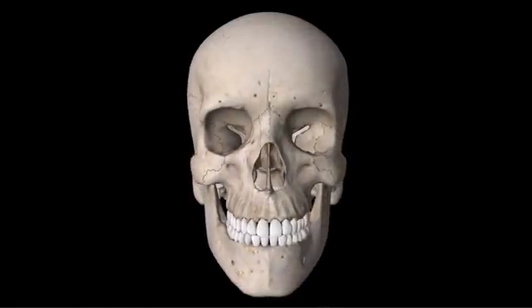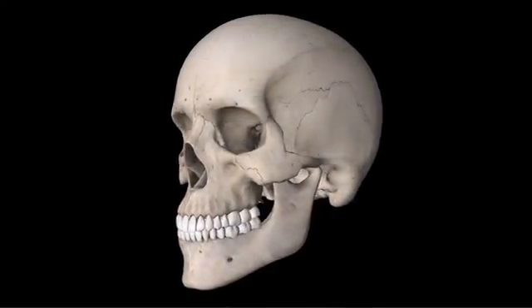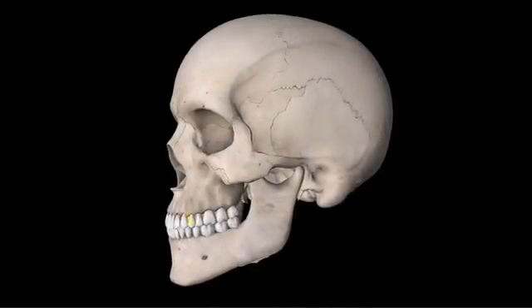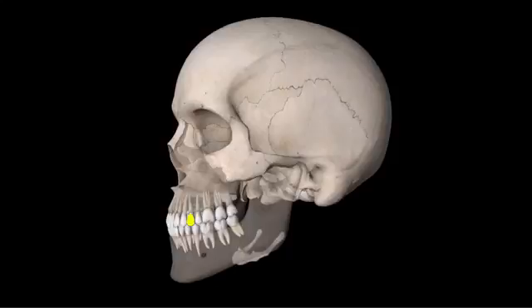So for us to understand the SLOB concept further, let's assume the upper left four is post-crowned. Externally, we can only see the crown, and here it is. The maxilla and the mandible are faded to visualize the roots. Pay more attention to the upper left four. The root appears to be one, because the buccal and the palatal canals are superimposed on each other from this view. Okay, so for us to determine the position of the post, we need to have two images, remember.